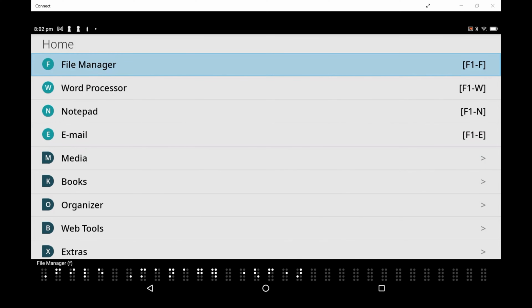So with all that out of the way, let's talk about email. I'm focusing this evening on the BrailleSense built-in email software. Because this is an Android device, there are lots of other email applications you can use. You could, for example, use the stock Gmail app, Aquamail, or Microsoft Outlook. In my opinion, nothing is as efficient as the built-in mail app. It does have some limitations for sure, but it is probably the most efficient way to get access to your messages, and certainly for new users, it's probably the most straightforward way to do it.